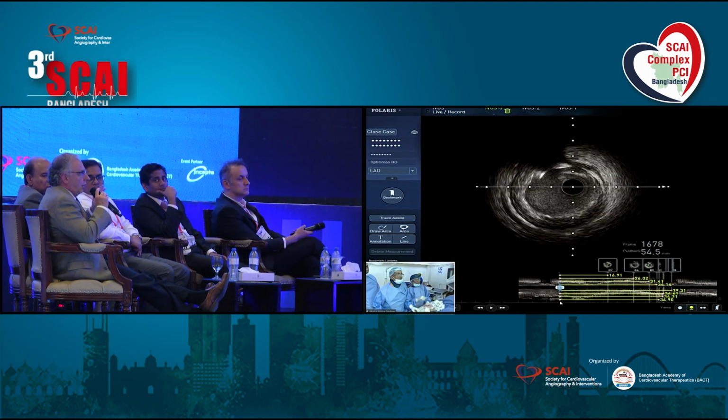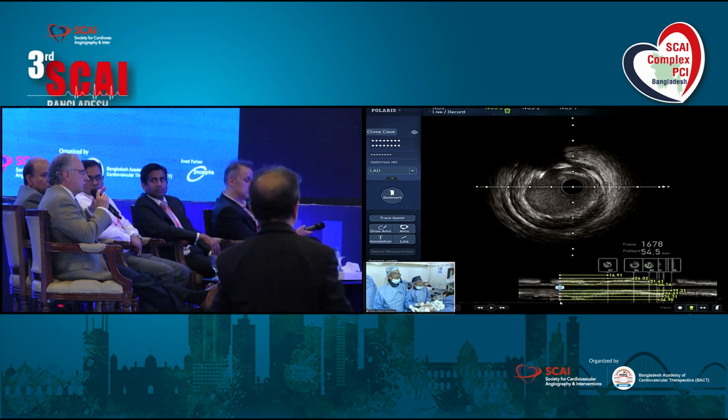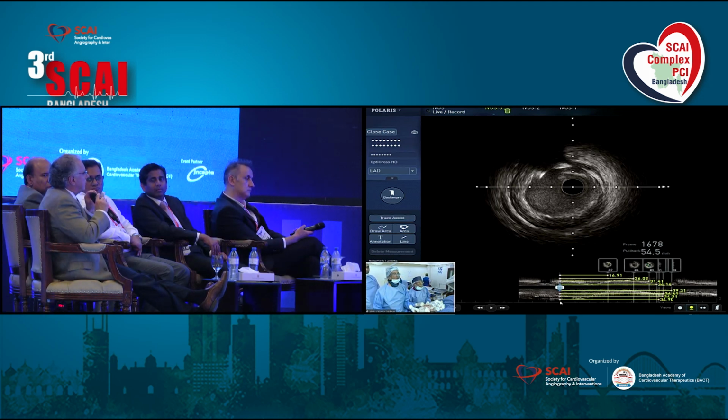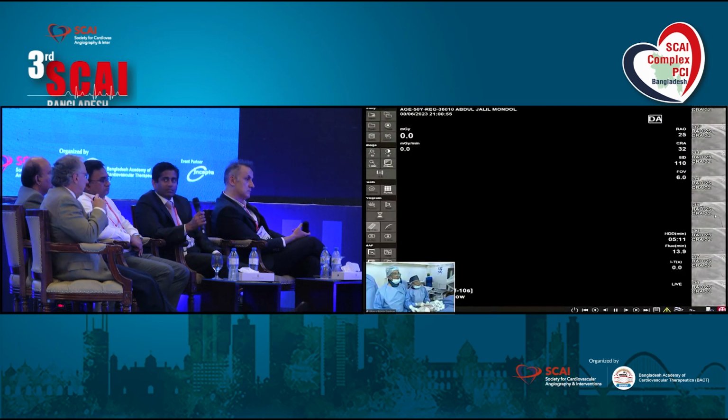So what are you measuring? Are you measuring the lumen in that specific spot, or the EEM in that specific spot? And when you say we have an 80%, 60%, or whatever percentage, are you using the percentage on the EEM, or the percentage in the lumen that you are measuring? So everybody has a fair understanding of what we are saying.